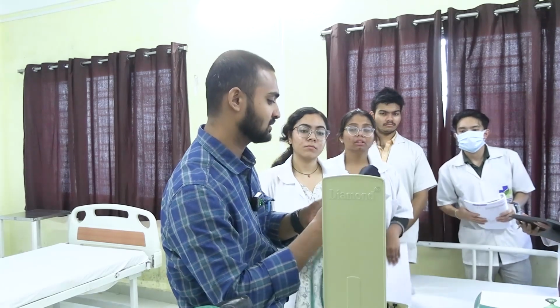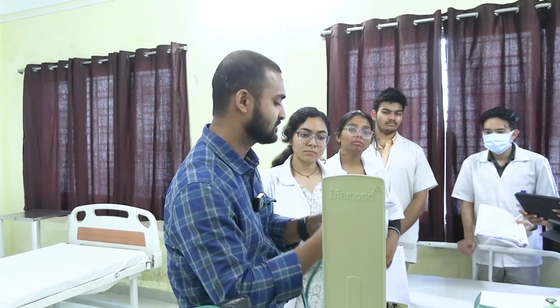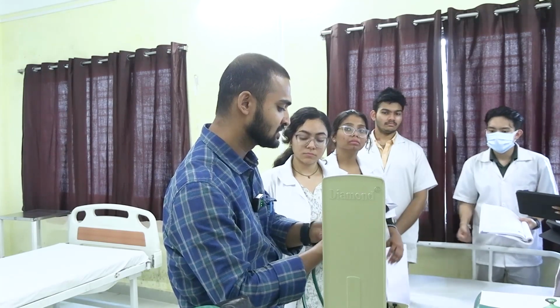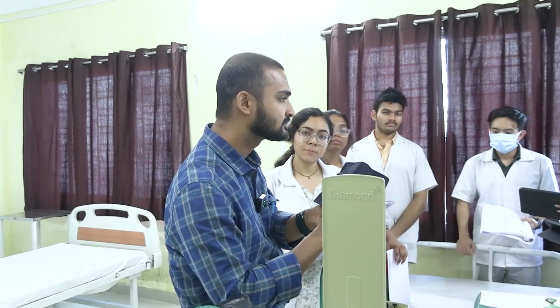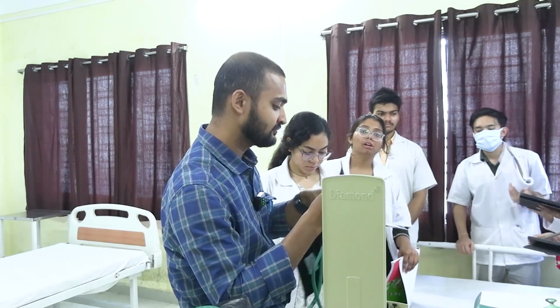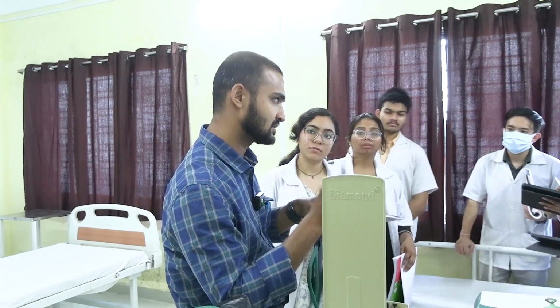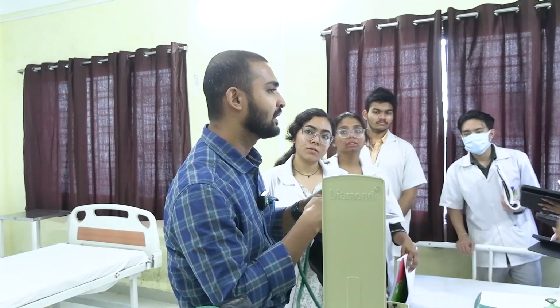Okay, first let us know something about the cuff. So this cuff, as I told, the measurement is 23.5 centimeters. This is the length. What is the breadth? 12 centimeters. This is for adults.